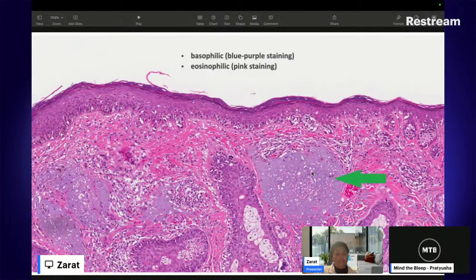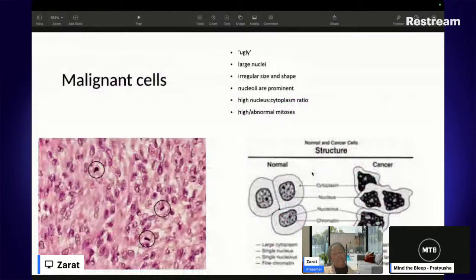And it can be perfectly normal, but again, they help us. They give us clues if we're thinking that the person has a disease in the skin. A big part of being a pathologist is being a detective. We're always looking for clues, whether it's clues from the clinical history or clues when we're looking at slides under the microscope. And these are the kind of small things we just collect. And then that helps us reach the final diagnosis.